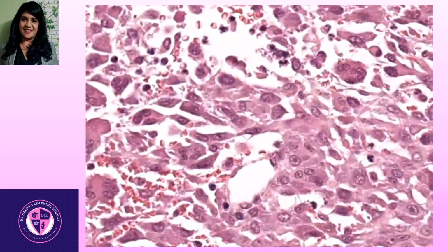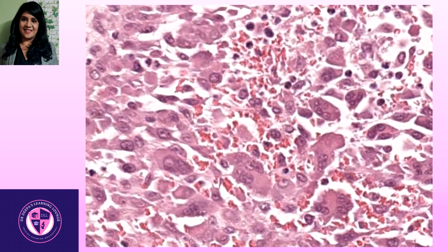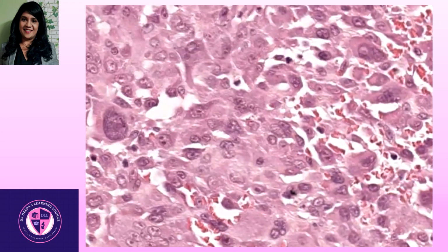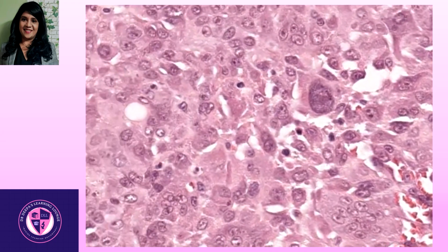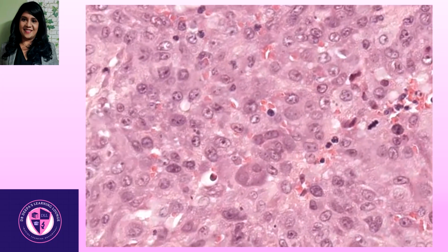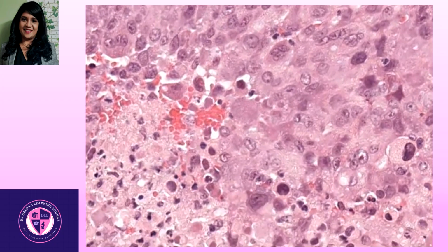Microscopically, the anaplastic thyroid carcinoma is a widely invasive hypercellular neoplasm with extensive necrosis and remarkable pleomorphism. If you can see the cells here, they appear so bizarre. There are multiple morphological patterns which can coexist in a single tumor. So that is what you see here.